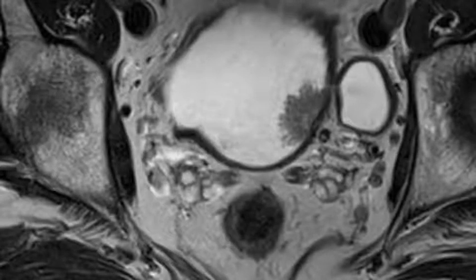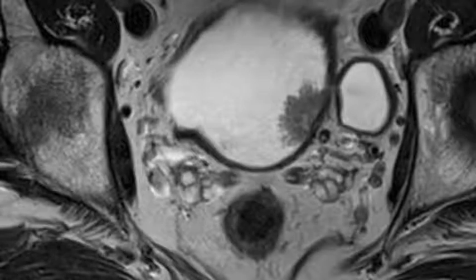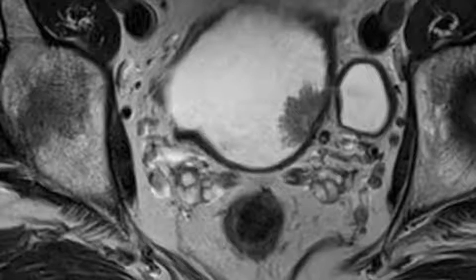Diffusion-weighted imaging in bladder cancer has been evaluated in terms of diagnosis, staging, prediction of histologic grade, and assessment of the efficacy of induction chemotherapy. It has shown improved differentiation between the tumor, muscle layer, and thickened submucosa, all of which have different signal intensities at diffusion-weighted images.